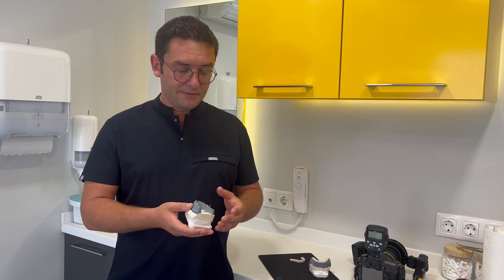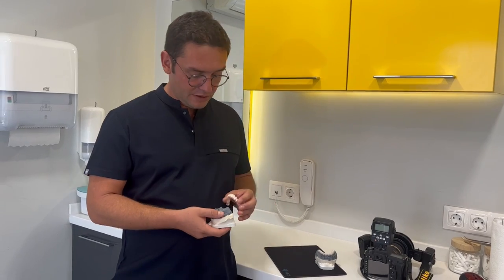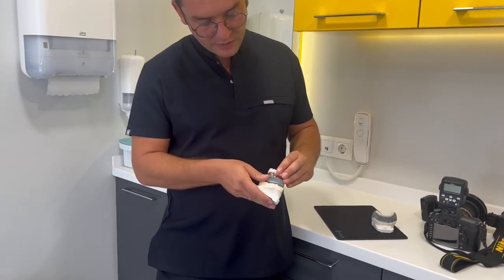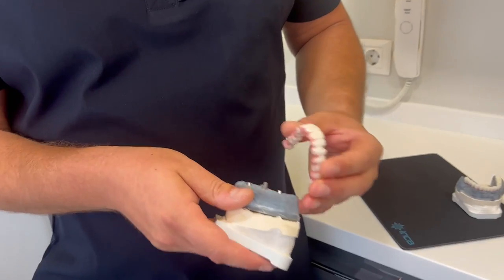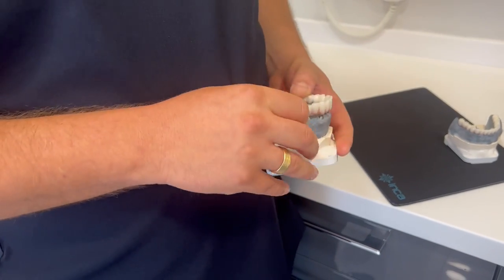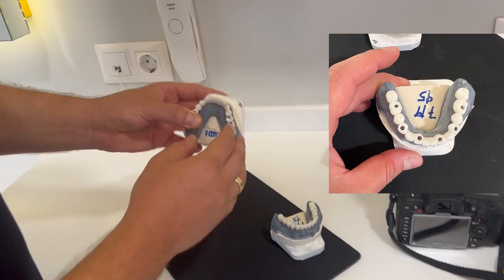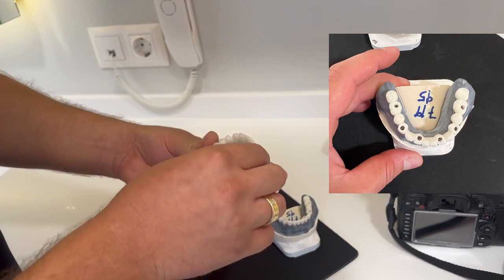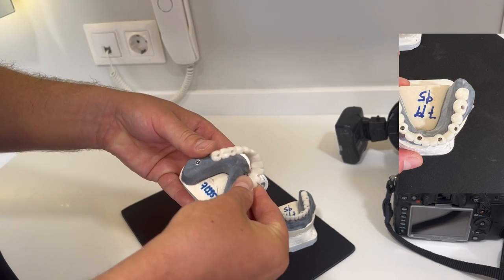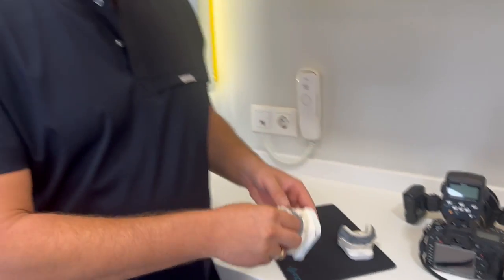Today I am meeting my patient — she will be here in about half an hour and I will fix these teeth. After fixing everything, as you can see here, we are going to close the screw holes. This gives us the ability to remove these teeth anytime we want. I hope our patient will like it, and I am going to share the before and after photos with you.